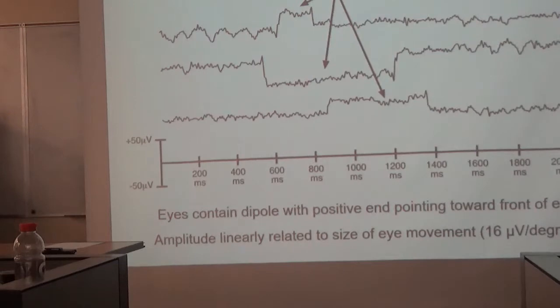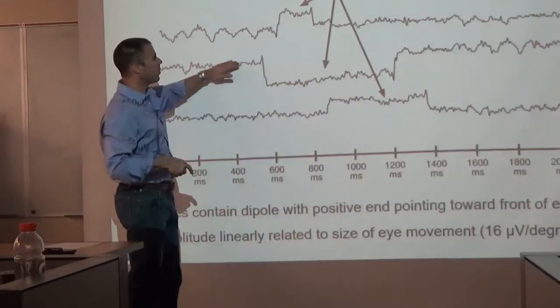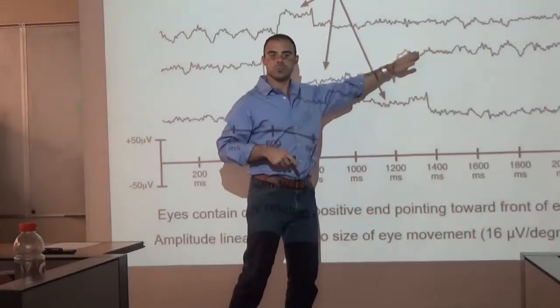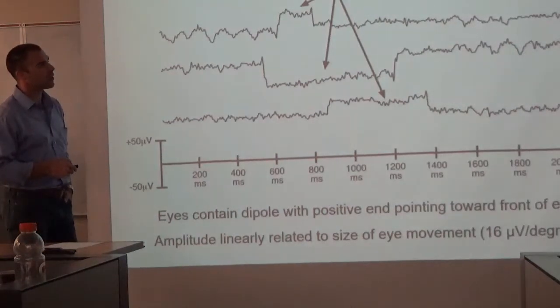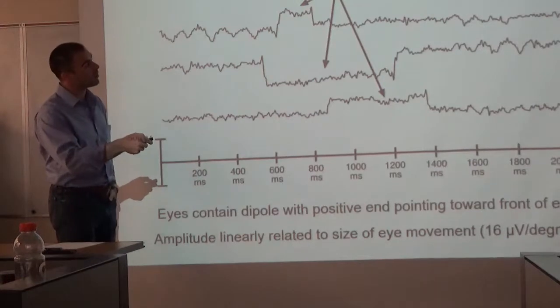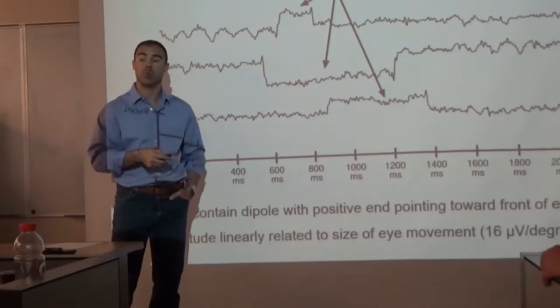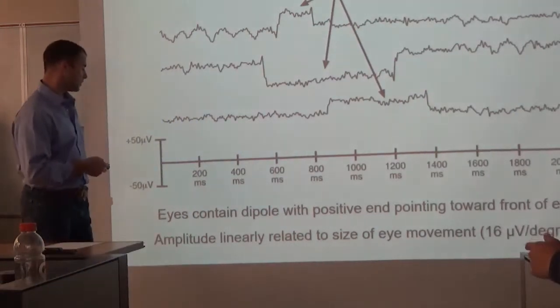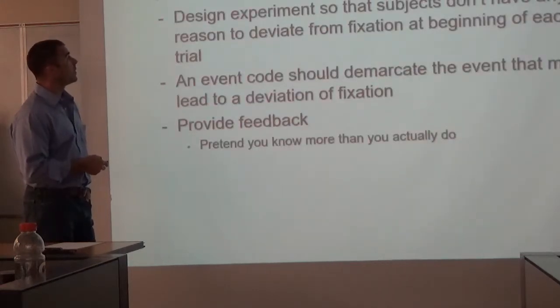We've introduced this idea of saccades already, right? Where you have the electrical activity moving along, and then you have that eye movement left or right. It's kind of some examples of what that might look like. Okay? And you remember when we were drawing it earlier today, we put that little L or the R there to indicate the left or the right side that it was recording from. So we have that as some artifacts of the horizontal direction.